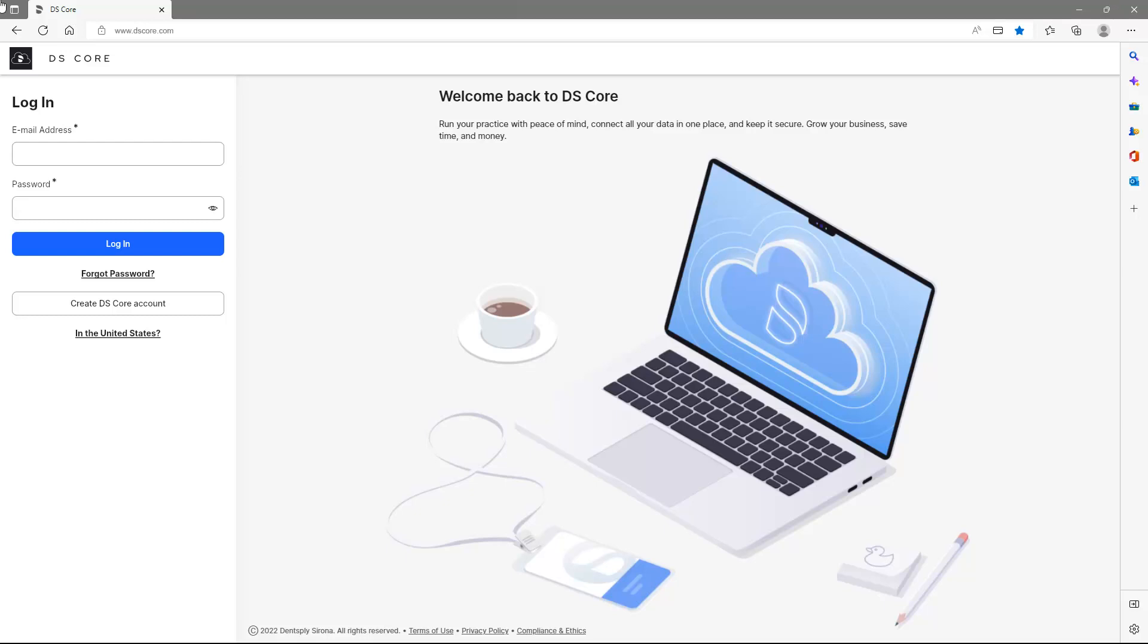DSCore is a cloud solution for dentistry that offers you a comprehensive patient media library by gathering all patient case files from your Dentsply Sirona equipment.